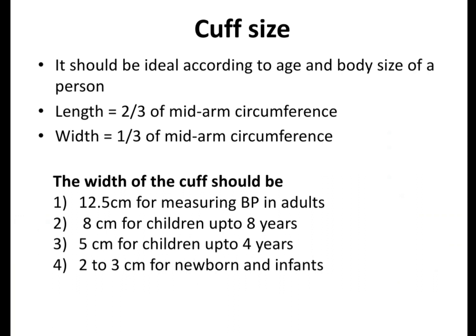Length equal to 2/3 of mid-arm circumference. Width must be 1/3 of mid-arm circumference. Width of the cuff should be, in adults, 12.5 cm; in children up to 8 years, 8 cm; in children up to 4 years, 5 cm; newborn and infants, 2 to 3 cm.